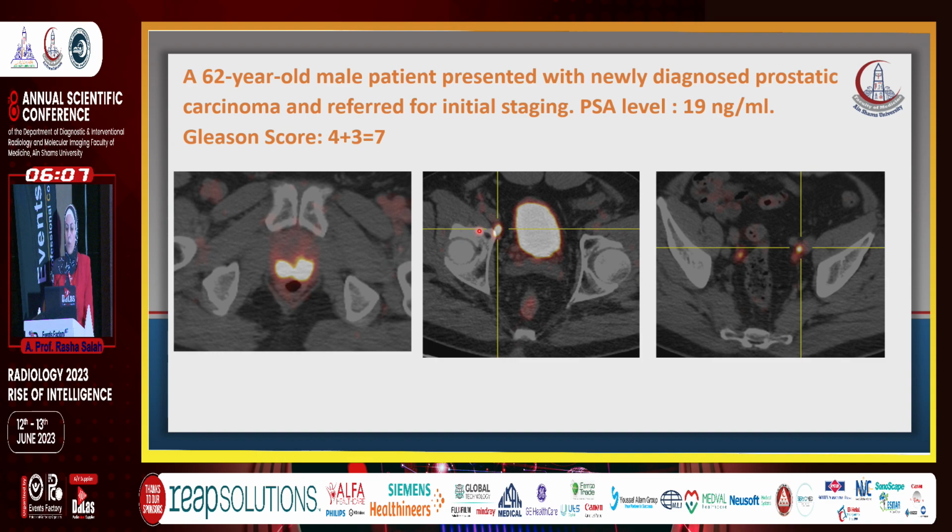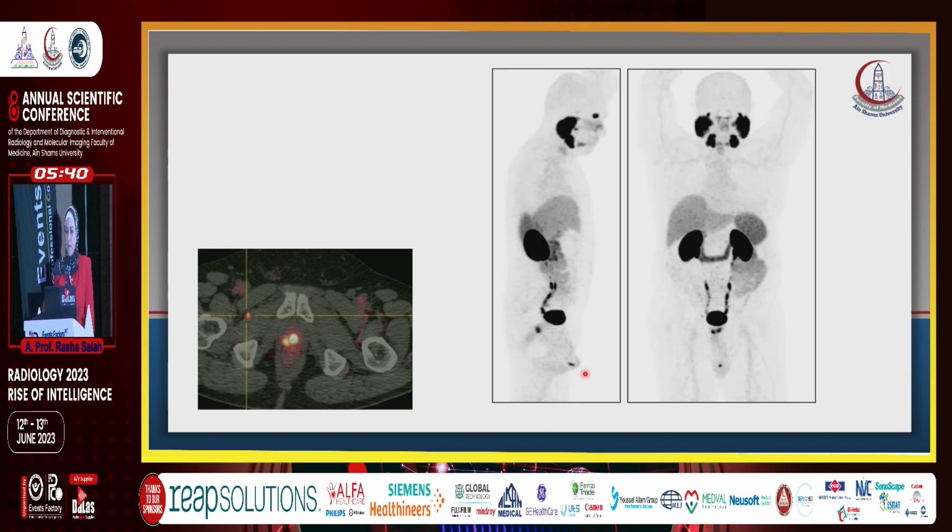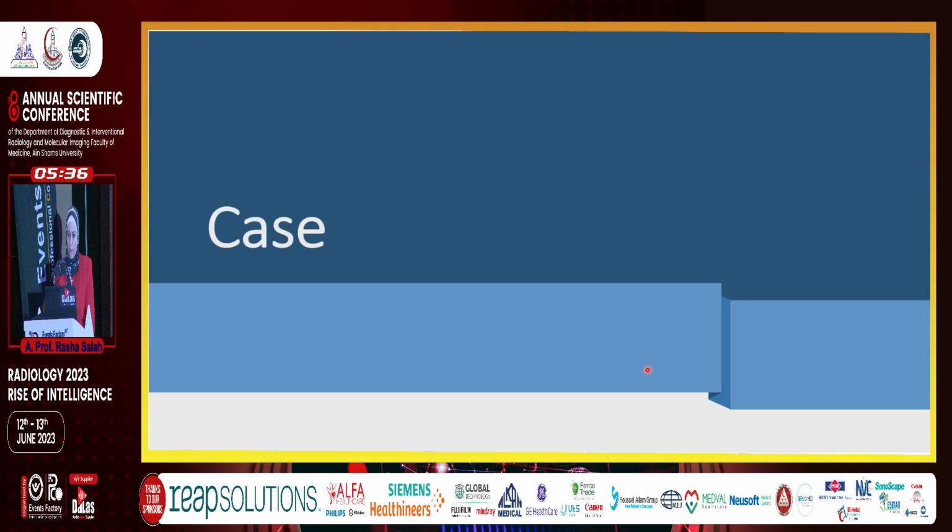And these are small metastatic pelvic lymph nodes that could be easily missed if we are doing the routine CT staging process. And unfortunately, there is an uncommon site of metastasis noted also in this patient, with this small obturator lymph node located over here. It is not common to search in this lymph node group for metastatic disease, but it was proved to be metastatic disease. And this is the fused image showing the whole metastatic process.